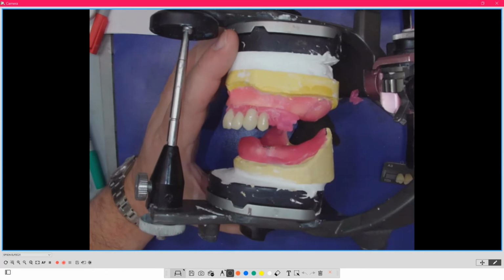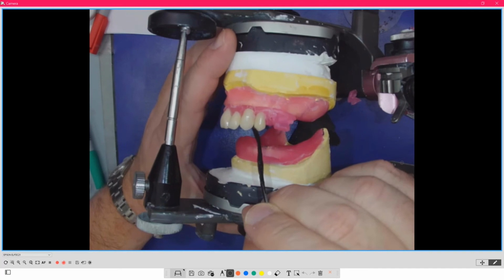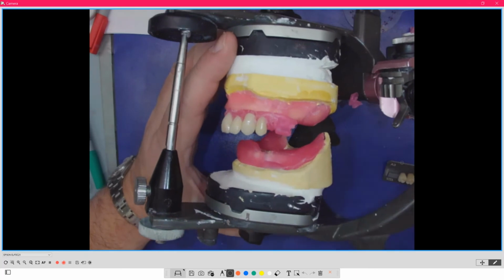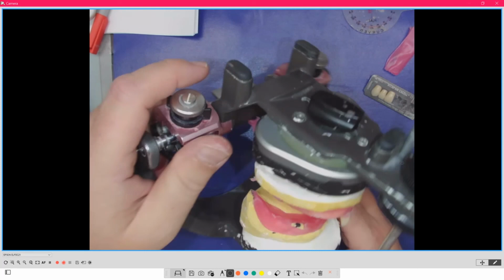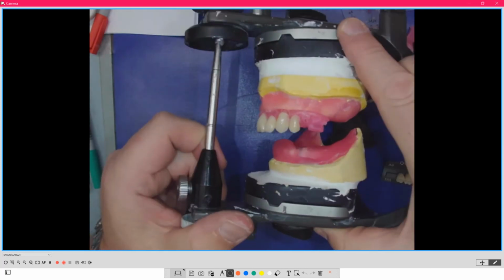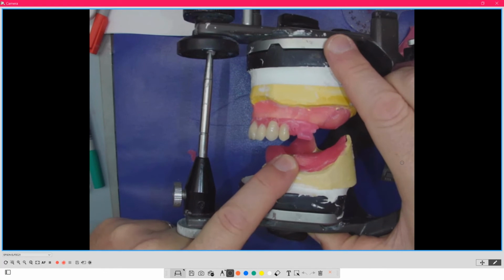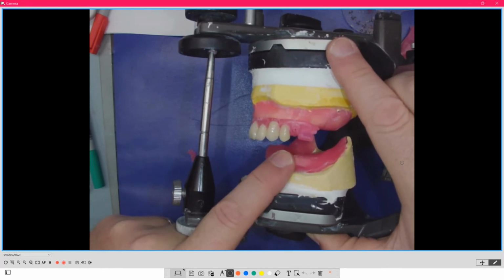So what I'm looking for, again, is just this triangle that's developing here between the distal cusp, pardon me, and the mesial cusp here of the premolar. So usually on class 2s, and let me just flip to this side, usually on class 2s, you can already start to see there's a discrepancy here to say, well, geez, depending on how class 2 this is, wow, Mark, I'm going to be hanging my lower out in midair.